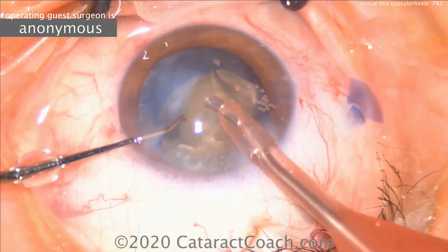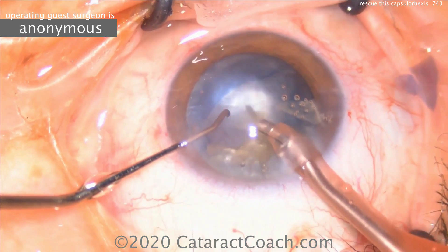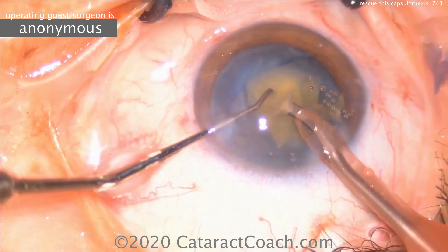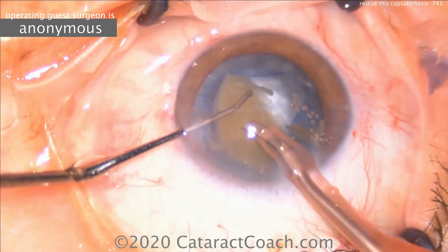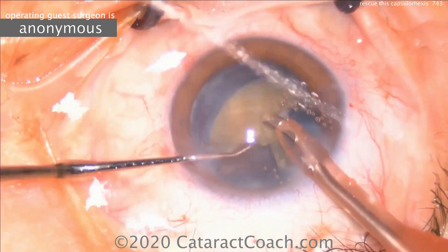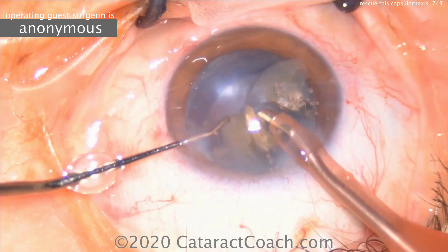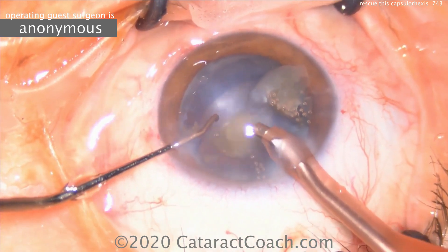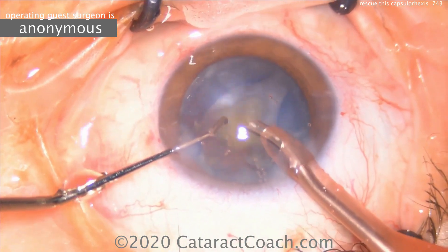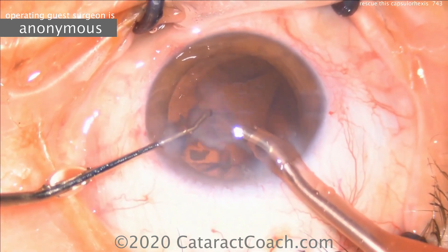What could we have done to prevent this Argentinian flag sign? We can help by decreasing the pressure in the capsular bag. In the previous techniques shown, we've kept the anterior pressure in the anterior chamber very high by only having one or two small paracenteses incisions. Don't make the big phaco incision because that won't allow you to pressurize the AC enough. Once you pressurize the AC with viscoelastic, your goal is to make the pressure in the AC higher than the pressure in the capsular bag, which comes from the liquefied lens cortex both in front of and behind the nucleus.